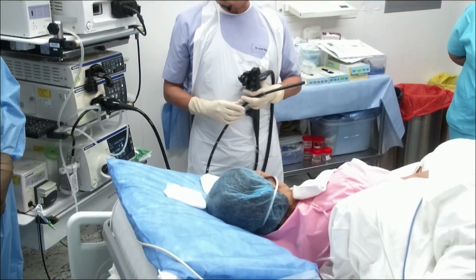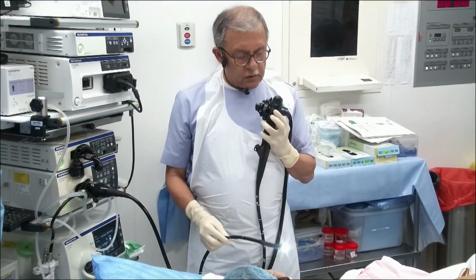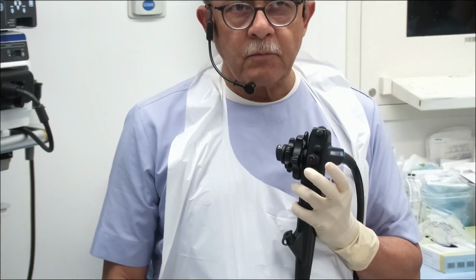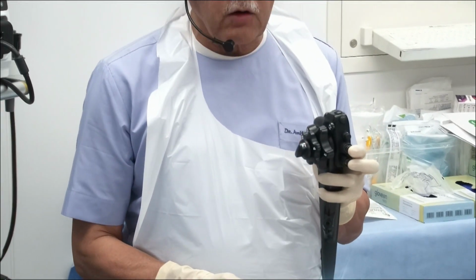The patient is already sedated, and now, as I described before, we are holding the scope in the left hand with my 2 fingers. My middle finger is on the air water button, whereas my index finger is on the suction button. Now the first thing I am going to do is to fix the small wheel in the center.